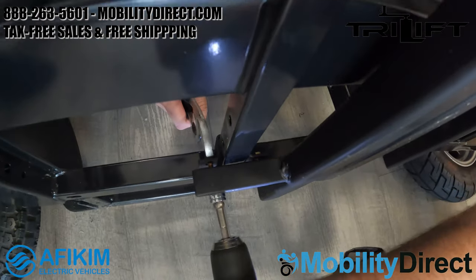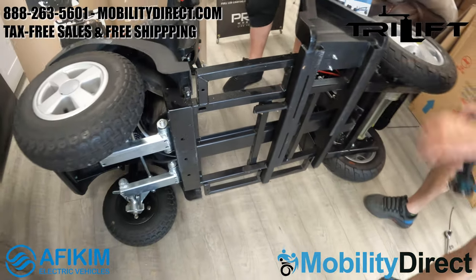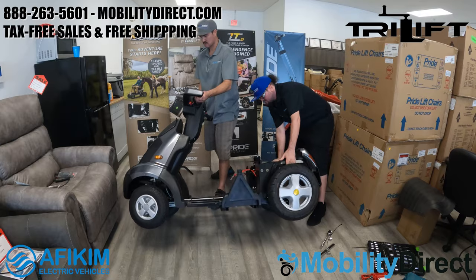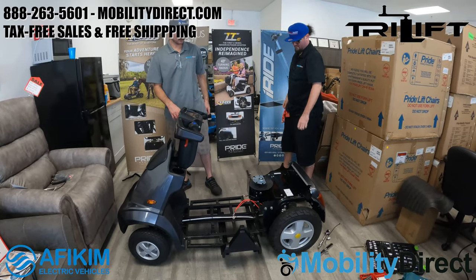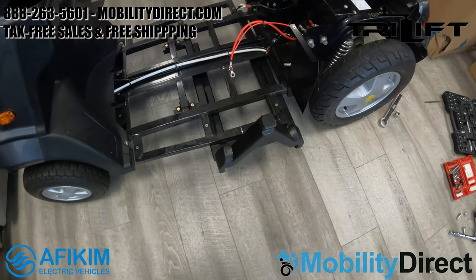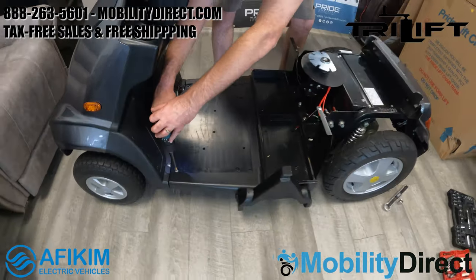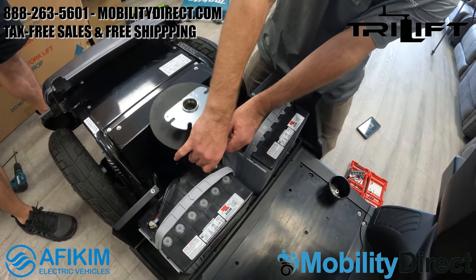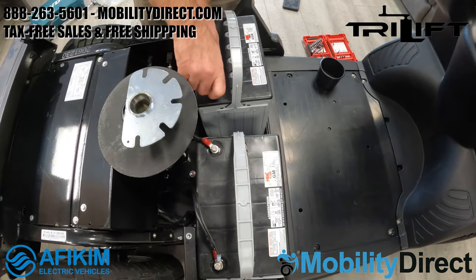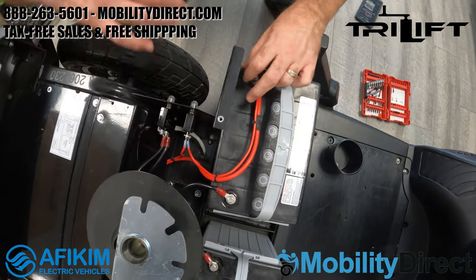At this point the bracket is fully installed. We just need to reinstall the batteries, the floorboard, the floor mats, the seat, and everything. This whole process took about an hour — it can take more if you're not experienced. We made this video to help both technicians and consumers who want to install the bracket on their own. The tri-lift application is very easy to work with, and you don't really need to take it to a shop if you're handy and have the tools.